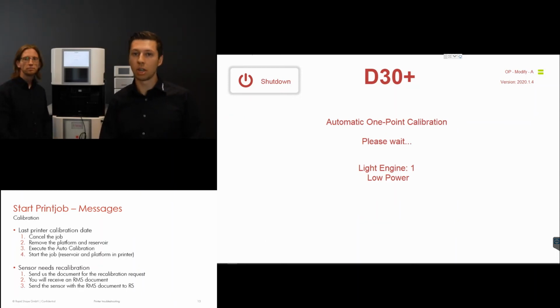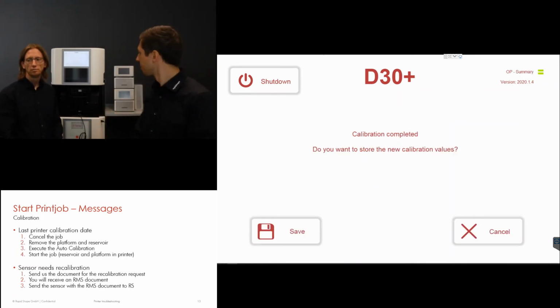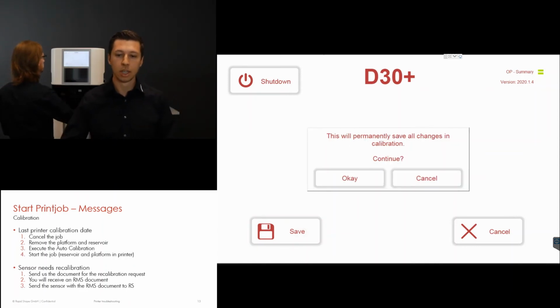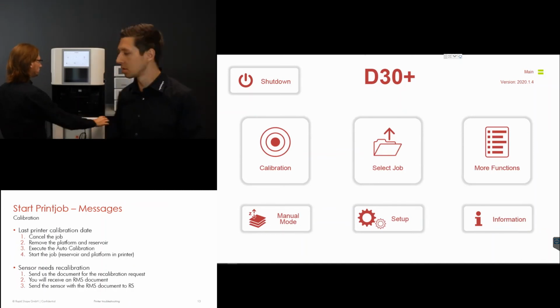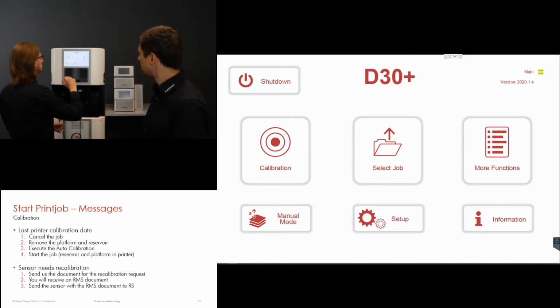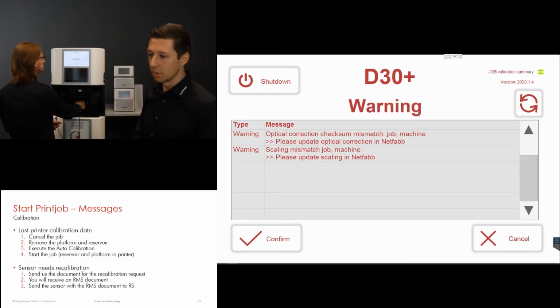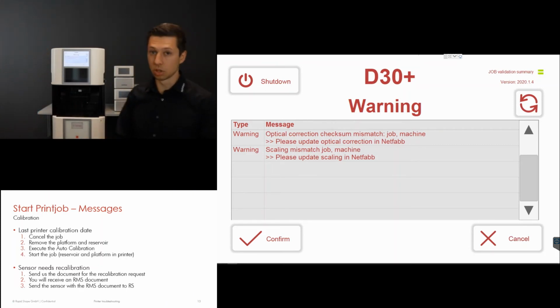The machine is now allowing a bigger deviation. So now if the sensor and the machine are pretty much different, it still says calibrate, I know what I'm doing. All right, okay. Beautiful. Calibration is completed. We save the calibration, and now the issue with the calibration is gone. So we can have a look in the select job again. Let's take the first one. So we did the calibration, and now there are still a few messages. I think Robert can show us when he got rid of all the other things.